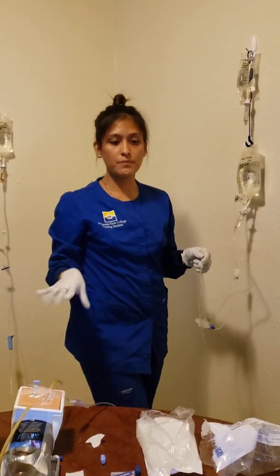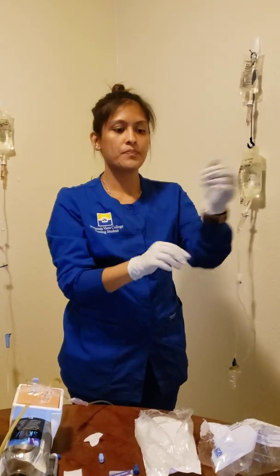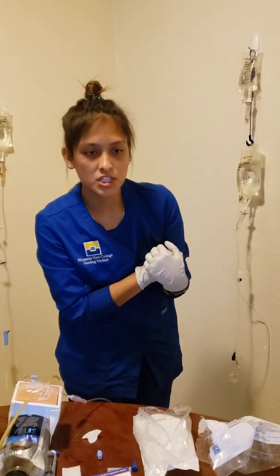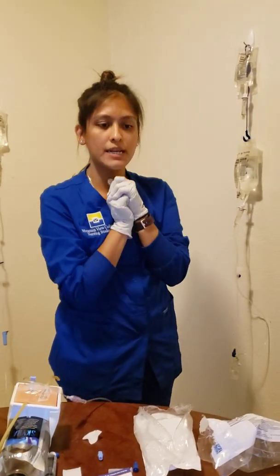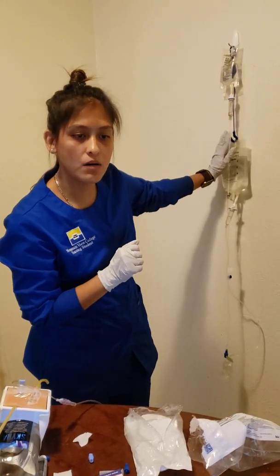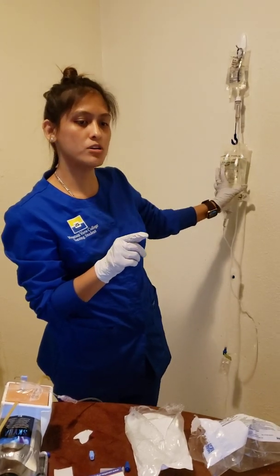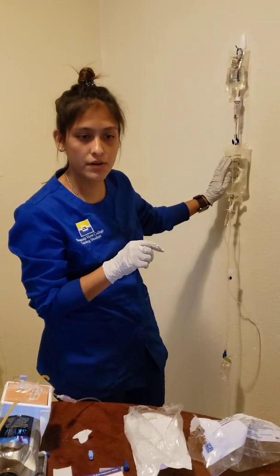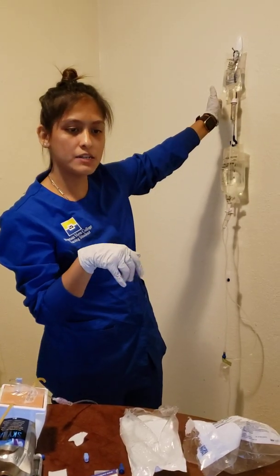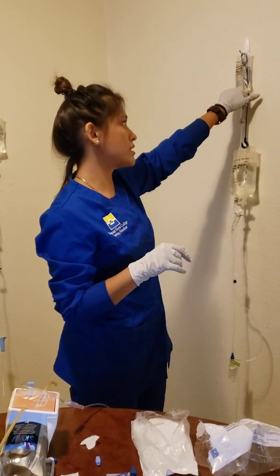I have not started my med. So this is going to be my third check. I'm going to want to look at Miss Chi. Miss Wanda Chi, 920, 19XX, 8 o'clock. I'm giving 500 ml of 0.9% sodium chloride to infuse over 10 hours. And I do have my 500 ml here that I'm gonna give 50 over an hour. And then I have my 8 o'clock ampicillin, 500 mg to infuse over 30 minutes. And this is in a 100 ml bag.